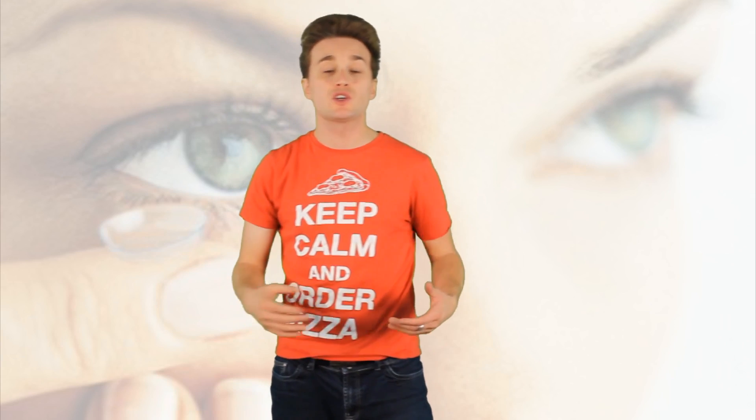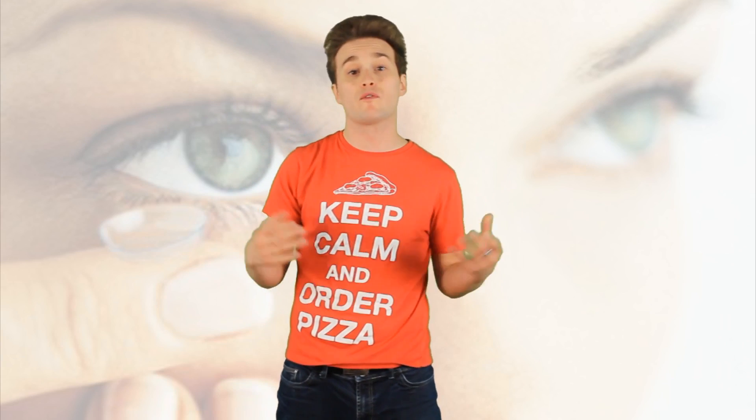But if you want hawk vision you have to have 20/2 vision. Now this procedure only takes 10 minutes to do — it's faster than going through a drive-through at 5 o'clock at McDonald's. Presbyopia actually affects over a billion people on the planet, all over the age of 40.